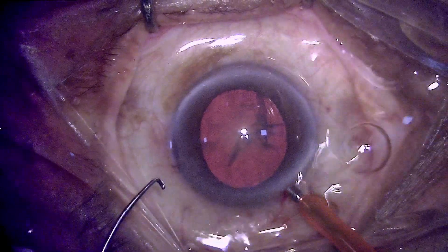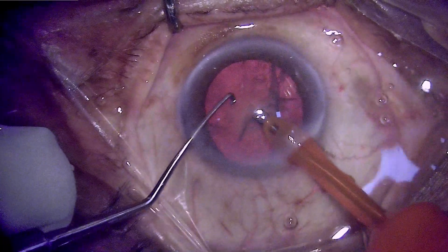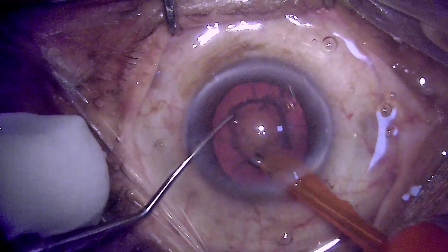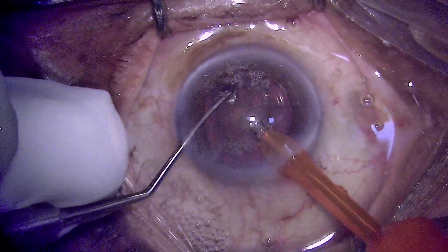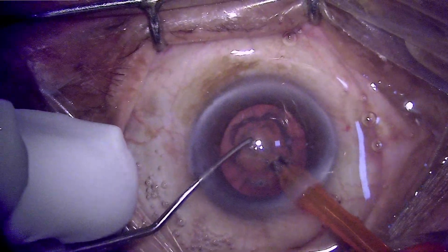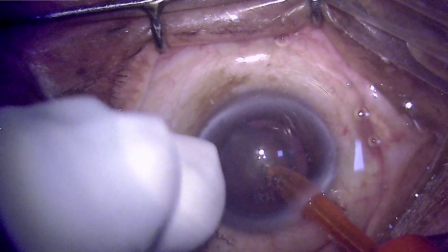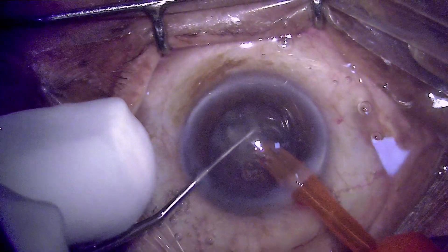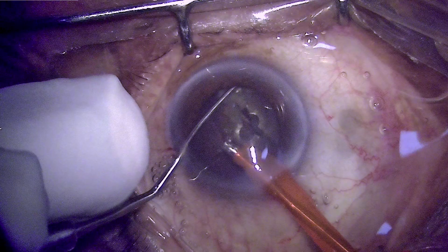Hard cataracts are a problem because most of us are not aware that using adequate power is the key — removing the overlying cortex so that the bare nucleus is in front of us. The burst mode is the choice here because it provides a burst of 100% power which is adequate for such hard cataracts. If you don't use this adequate amount of power, a small amount of power will simply waste energy, prolong the surgery, and cause endothelial decompensation.